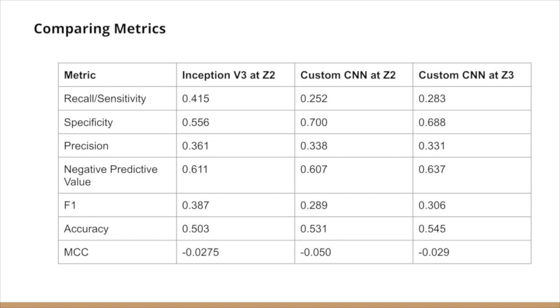Due to undersampling, we ensured that there was the same number of tumor and non-tumor patches. We suspect that our model may simply be close to a random model, which outputs its prediction at random, as can be shown by the close to 50% accuracy and close to 0 MCC metric. In fact, the MCC metrics for all 3 models are negative, saying that our models mostly disagree with the correct labels. The F1 score for our 3 models are low, with the highest for the inception model at 38.7%. This is also an indicator for why none of our models should be used.